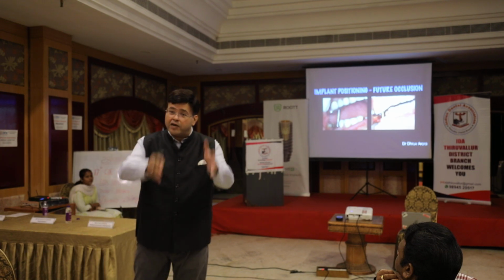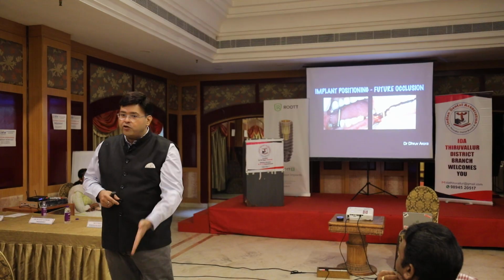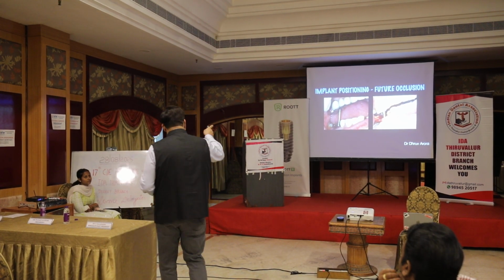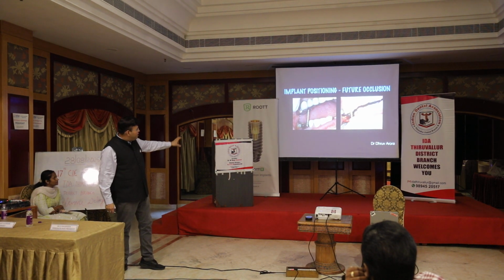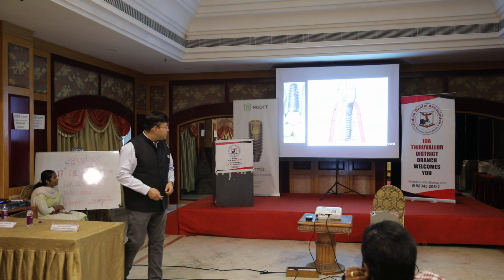The implant has to bear load, right? For that, it has to be at a unidirectional angle coming from the opposing tooth of occlusion. So this is where you start checking occlusion with your paralleling pins or pilot drill. Once I am okay with this, this will be my final line of placement of an implant.